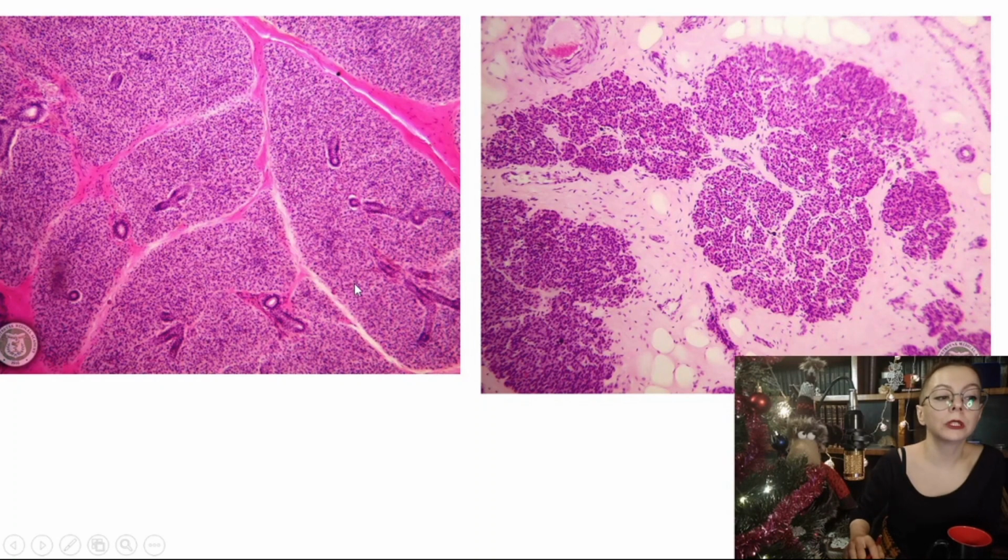Now, parotid gland versus parathyroid. They are similar, but of course striated ducts are very characteristic for parotid, so you can distinguish it. And in the parathyroid, usually connective tissue is very rich in adipose cells. So many adipose cells could be found, and the lobules are not very distinctive. They are infiltrated with connective tissue, and the border is not regular.